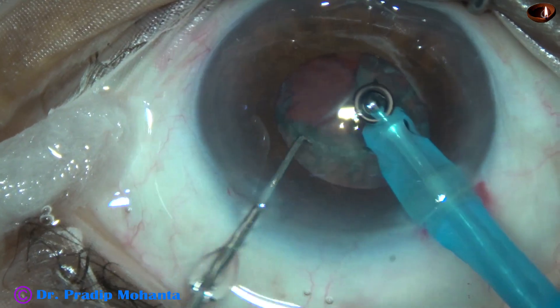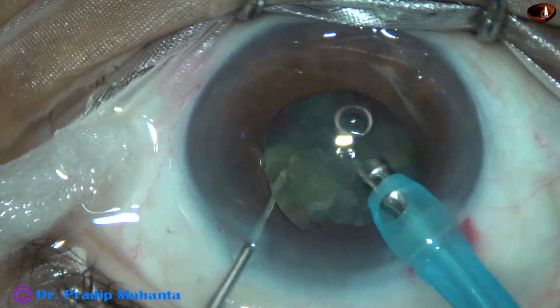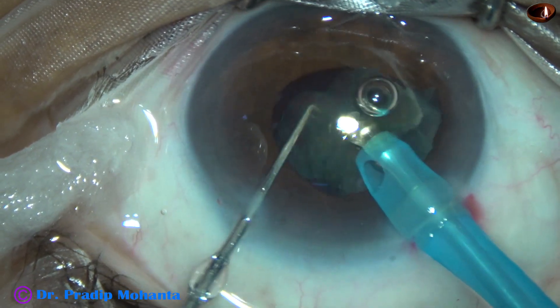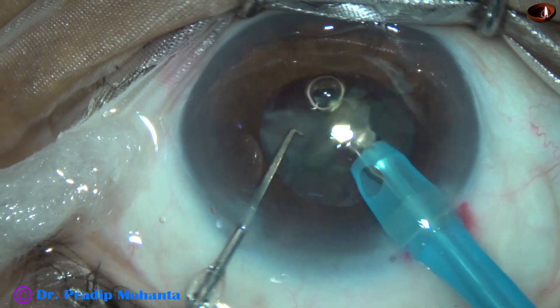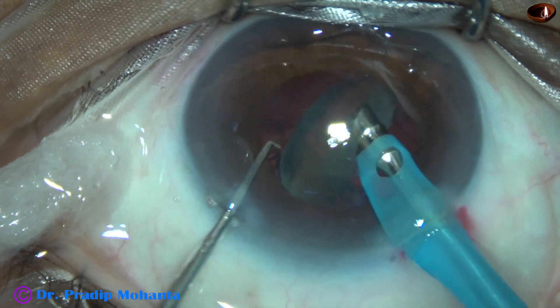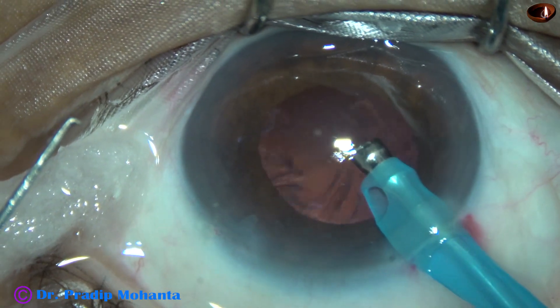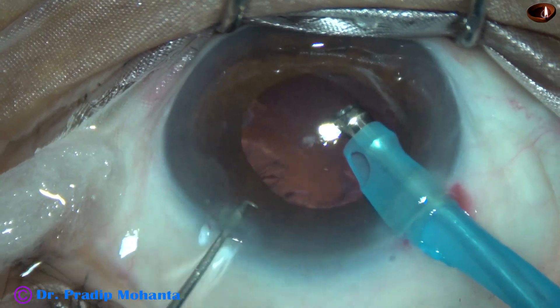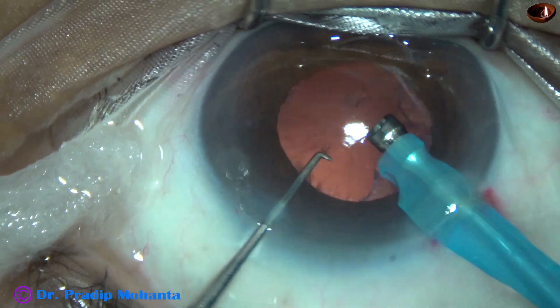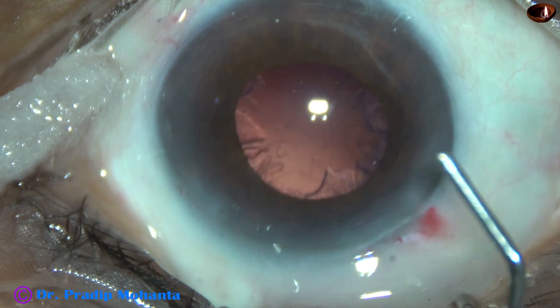At this time the pupil is tending to become small; the size is about 3.5 millimeters. But we can manage this case very comfortably because the nucleus is soft. If the nucleus were very hard and the pupil size became smaller, we would need to go for a pupil expansion device — but in this case we don't need that. Because of the wick, the ocular surface is remaining almost dry and the cornea is not getting submerged by a pool of water. Nucleus and epinucleus have been managed.